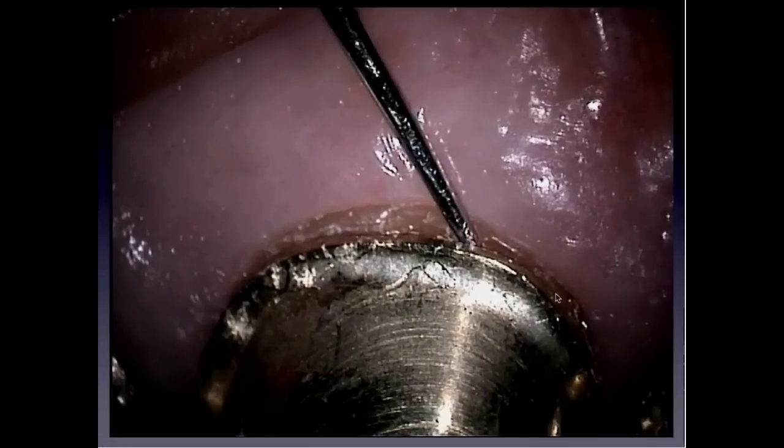This was also a lady with a telescope crown and prosthesis, and she was very scared that she would lose her last tooth with the telescope, because then she would have a jiggling prosthesis. And I was able to find a gap here between tooth and crown and some weak tissue. I could remove it with a very small burr and save the tooth, I think, for years still.